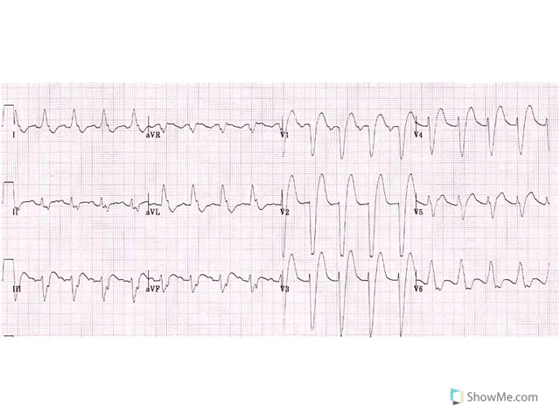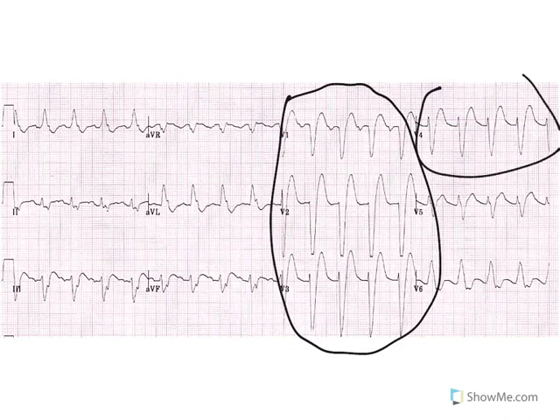We use it for left bundle branch block. And the problem with left bundle branch block is that it has a tendency to hide ST elevation on us, okay? If you look at this, look at your precordial leads, your mid-precordial leads, right? Look at these guys right here, and you can even add V4 into that if you want to. You look at these guys, and what you see is the J point could be anywhere, like up here. I mean, we could say this is the J point down here. That's fine, right?